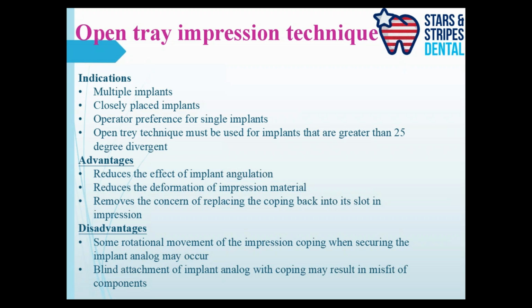Or if an implant is placed far too deep under the gum line, of course open tray would be the best choice. Or if you want to customize your implants in a certain way, open tray impression is actually a better choice. As I said earlier, in limited mouth openings and difficult to reach areas, closed tray works fine. That doesn't mean that you should not use closed tray technique. It's just that in certain individuals' hands, closed tray works better. I think in my hands, open tray works better. All right.